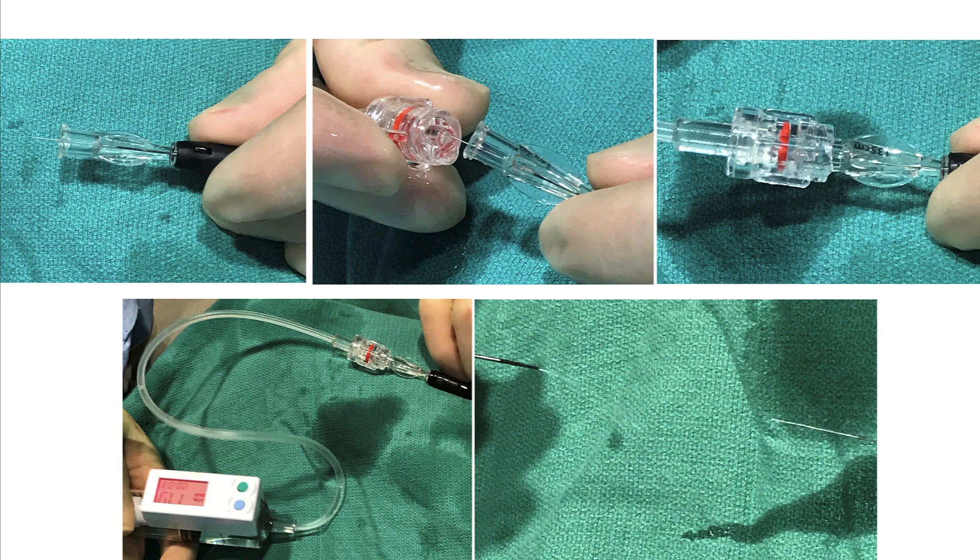The second technique is the hydraulic technique, performed by using an endoflator or a syringe with normal saline. We pull back the microcatheter as much as possible, connect the tip of the microcatheter to the inflation device, and then inflate to 15 to 20 atmospheres. This reduces the friction between the wire and the wall of the microcatheter, allowing removal while the guide wire remains in place. This technique is unpredictable — quite often it works well, but if it does not, you lose your wire, which can be a big problem if wiring was challenging.